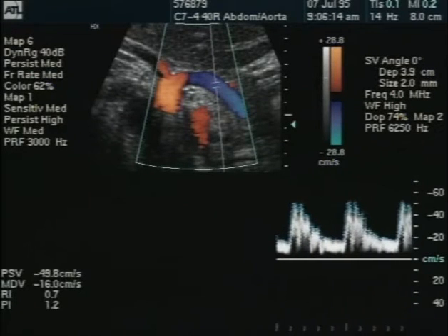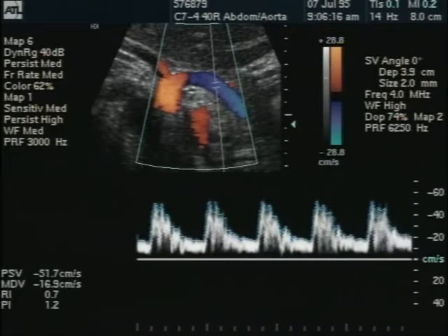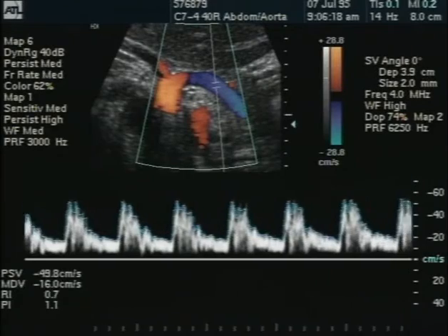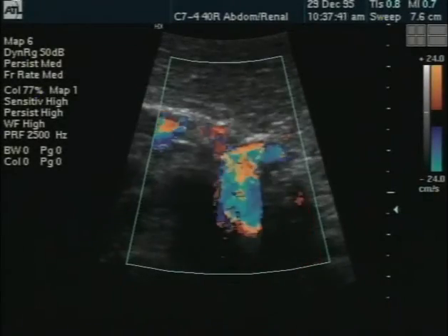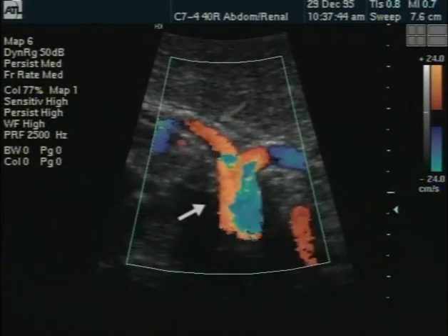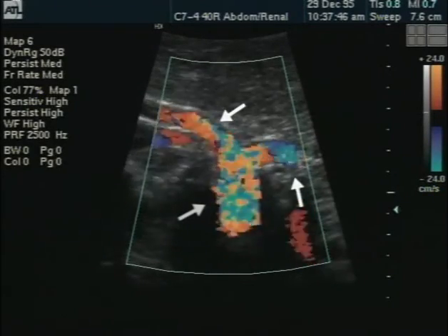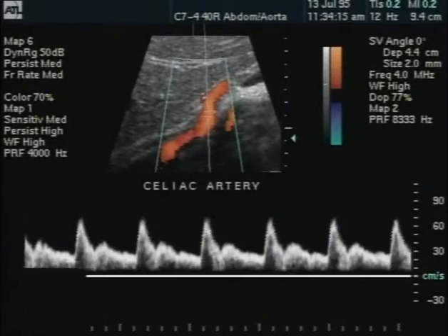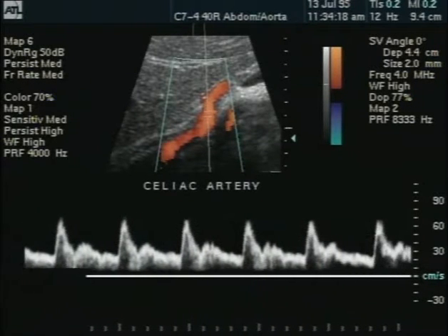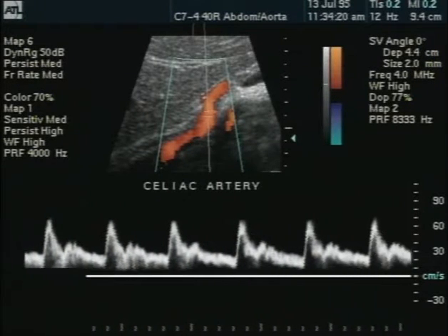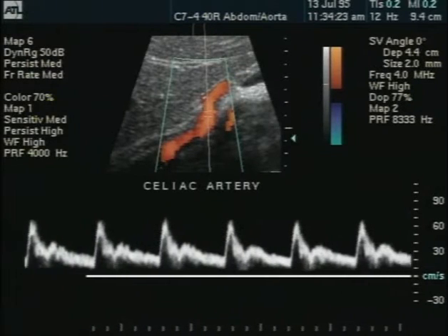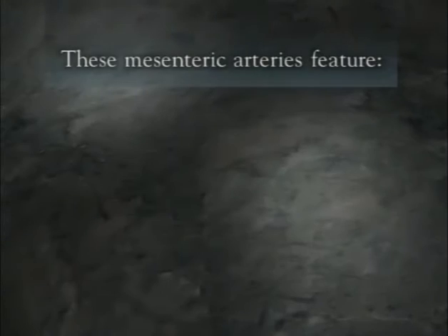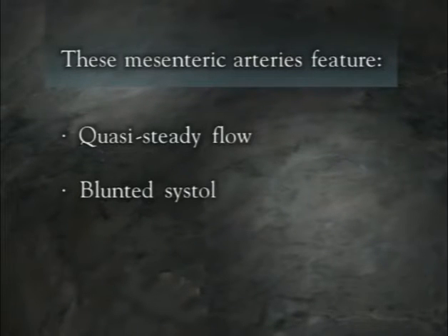These organs require constant blood flow to meet their metabolic demands and therefore have low resistance to arterial inflow. The normal Doppler spectral waveforms from the celiac trunk, common hepatic, and splenic arteries exhibit constant forward flow throughout the diastolic component of the cardiac cycle in both the fasting and postprandial states. Like the waveform from the internal carotid artery, the spectra from these mesenteric arteries feature quasi-steady flow and a blunted systolic peak.